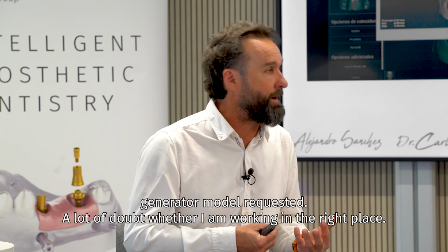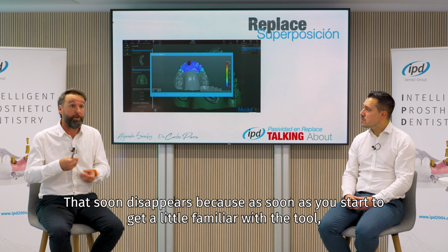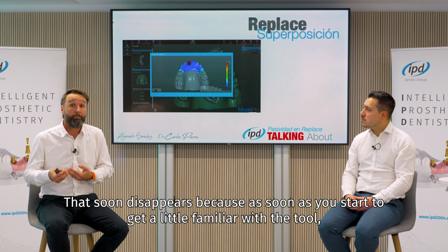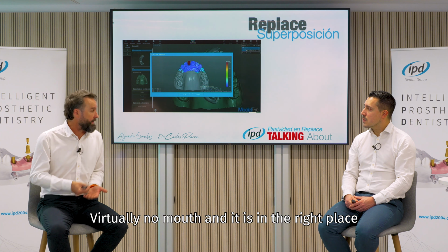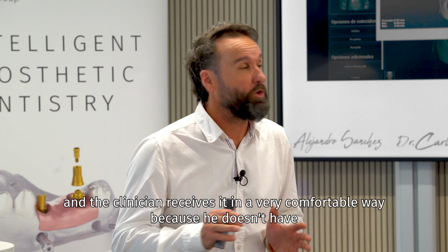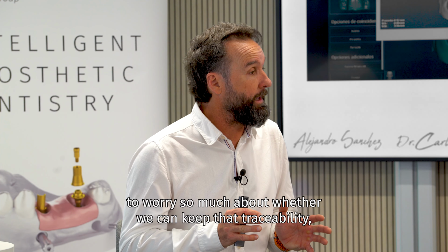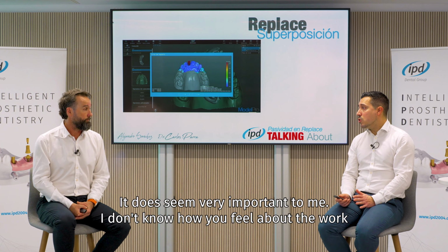There is a lot of doubt about whether I am working in the right place. That soon disappears, because as soon as you start to get a little familiar with the tool, you gain confidence in what you are making, virtually in the mouth, and it is in the right place. And the clinician receives it in a very comfortable way, because he doesn't have to worry so much about whether we can keep that traceability, but that the prosthesis he prescribes is the right one. We are going to have digital resources to be able to fabricate it. It does seem very important to me.